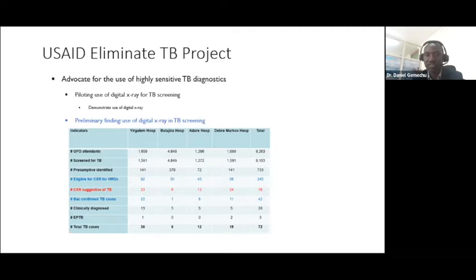As you could see from the graph, the red ones, the number of patients we found is around 76. These are patients who came to facilities. They were asymptomatic; they only had high risk. And if routine programming had been used, they would definitely have been missed. So screening with digital X-rays gives an opportunity not only to reach more patients, but also reduces the chance of missing patients within the facility and increases case finding.